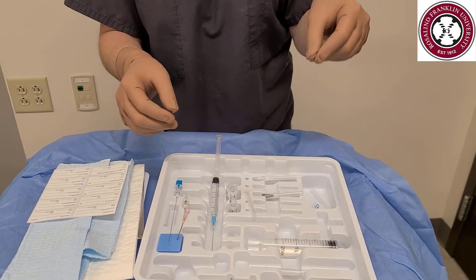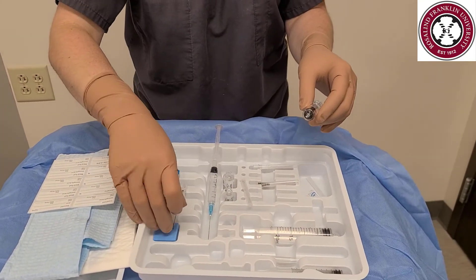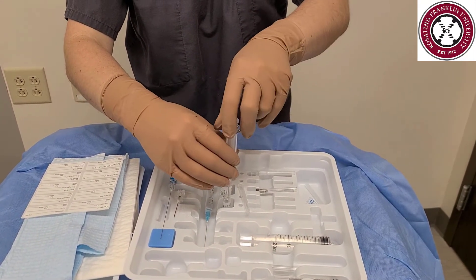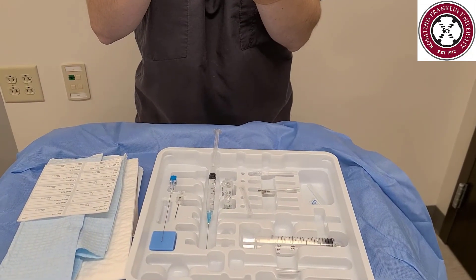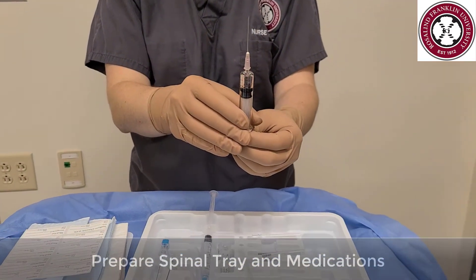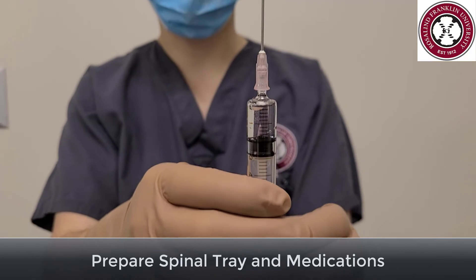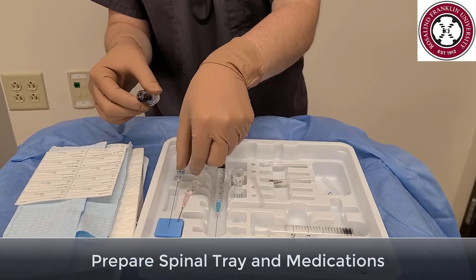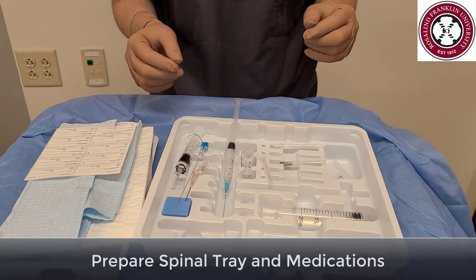Remove all of the air from the syringe and uncap the 25-gauge needle. I like to arrange my tray in order of use, with what I use first furthest from the patient and what I use last closest to the patient. Attach the large filter needle to the 5 ml syringe and draw up your dose of spinal anesthetic — in this case, 0.75% bupivacaine in a hyperbaric solution. Determine the correct dose based on the procedure to be done and your patient's height. Remove the filter needle and rearrange the needles and syringes to your preference. At this time, if you are adding any opioids such as Duramorph or fentanyl, you can add them now.